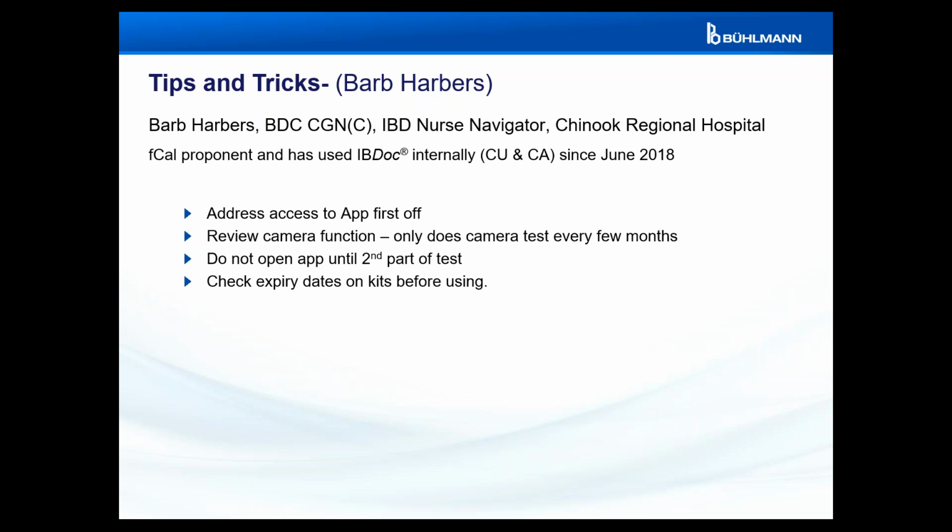If you're having trouble collecting the stool sample, it shows you how to do it. So what I tell patients now is, collect your stool sample. Don't even bother opening the app on your phone. Collect your stool sample, put it on your counter, carry on with your day. When you come back after your 2 hours or 6 or 8 or whatever it is that you're going to do the second half of the test, then open up your portal.